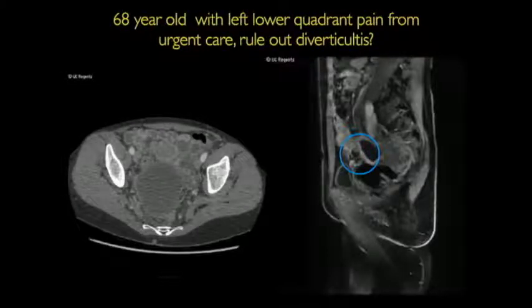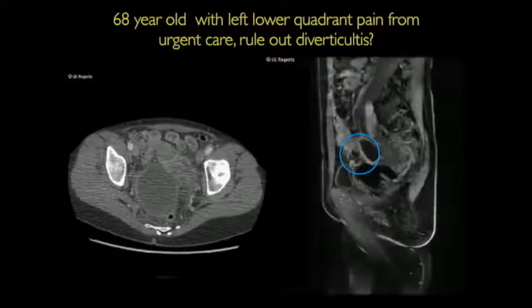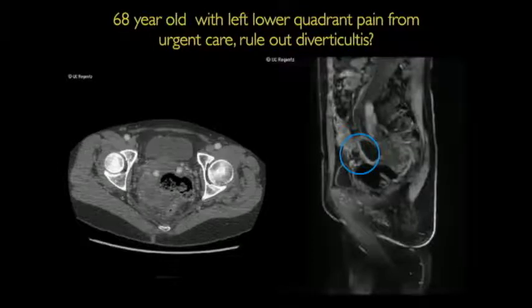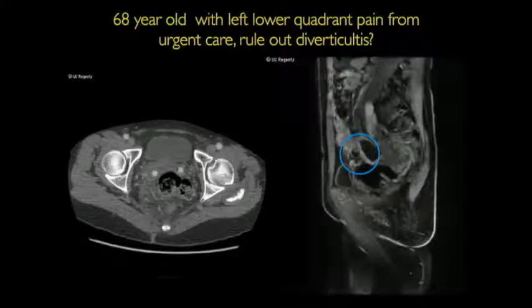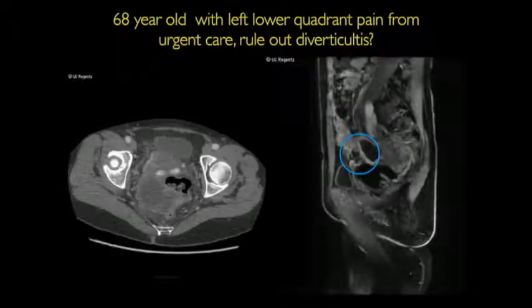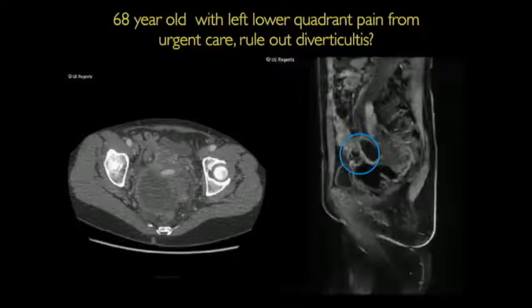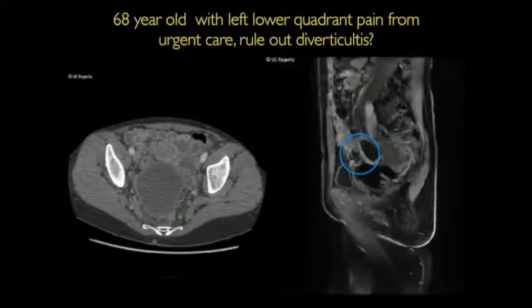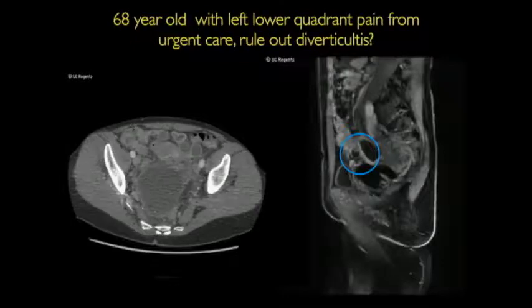She had a twisted benign ovarian cyst. And why did we go straight to MRI? Just because of the size of the lesion. It would have been quite difficult to evaluate in a postmenopausal woman to figure out what's the normal ovary and what's going on. So again, it can happen in postmenopausal patients, and if the lesion is large, consider doing an MRI to find the vascular pedicle.